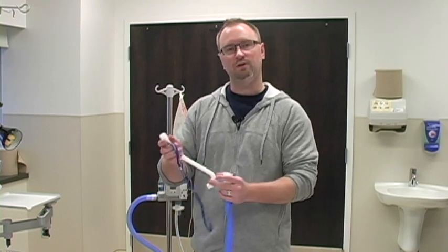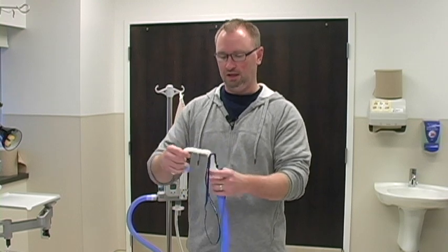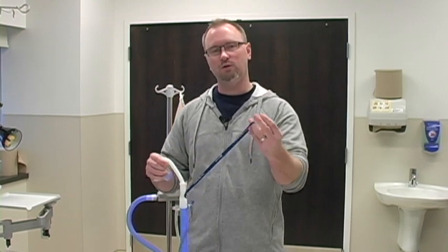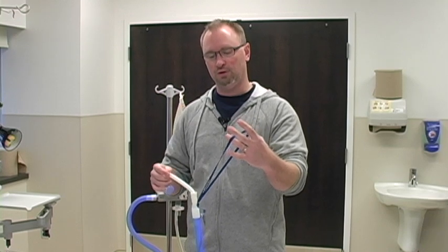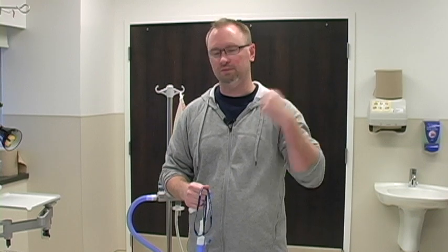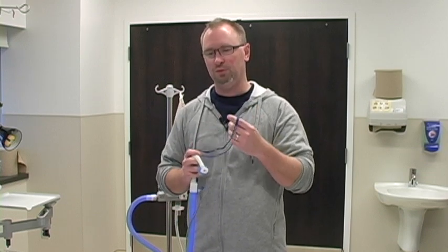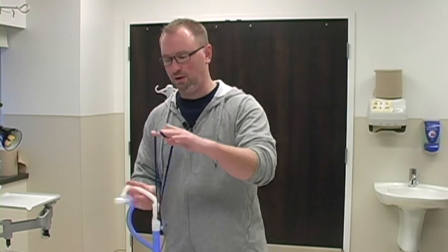So another option with Optiflow, other than the nasal prong interface, is the trach adapter for our trach patients. It has the same circle connector for the circuit itself. It only comes with one lanyard. I don't know if you noticed with the other lanyard for the nasal prongs, but it was a breakaway lanyard so that patients wouldn't unintentionally hang themselves or choke themselves. With the trach one though, it's not breakaway, with the thought being that if it did get pulled on, because it's attached directly to the trach, there's potential there for dislodging the trach. So this was actually one thing to be aware of.